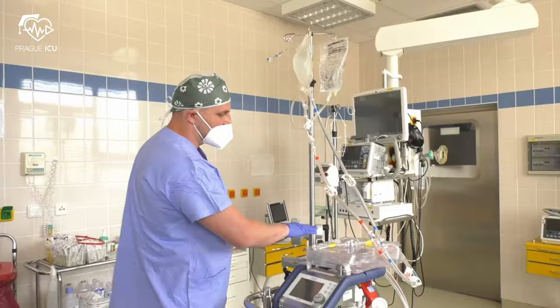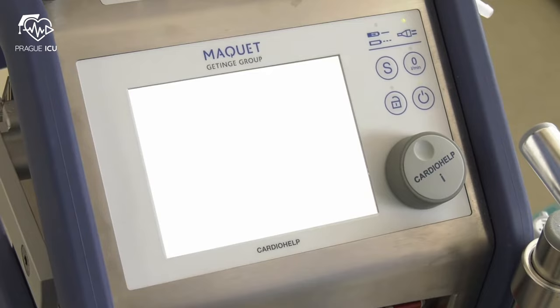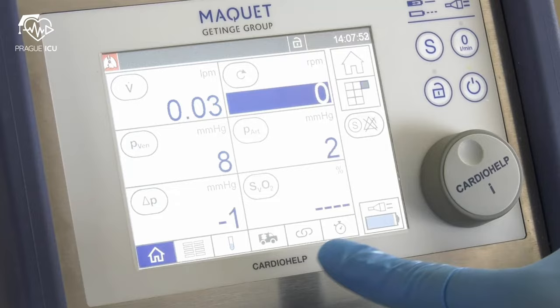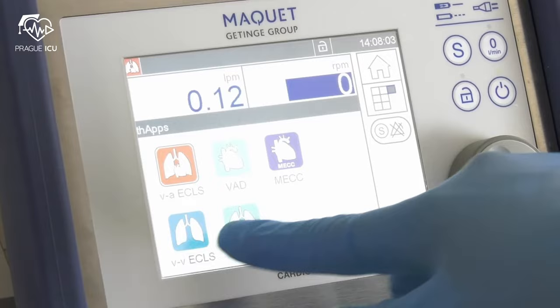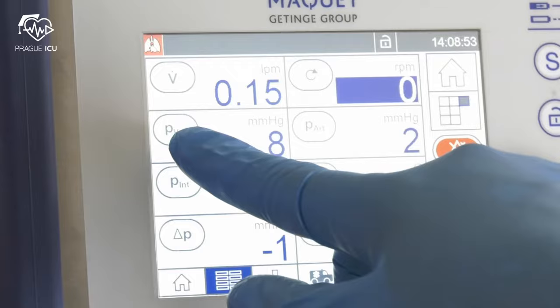Make sure there is a distance of at least 60 cm between the upper protective frame and the lower edge of the priming bag. Turn on Cardiohelp. Check the charging level of both batteries. Then choose the appropriate therapy and activate the mode Global Override.